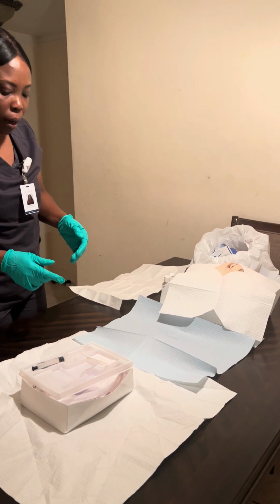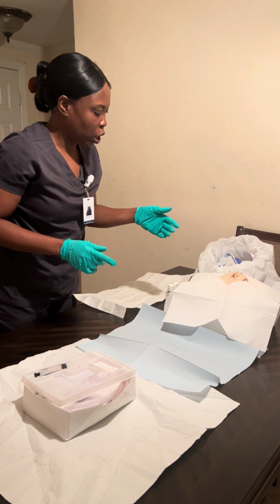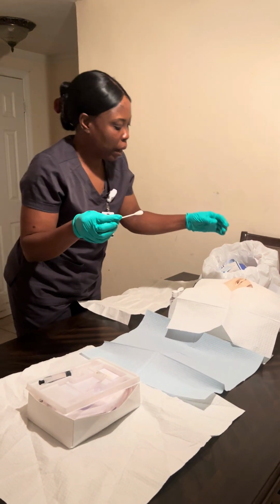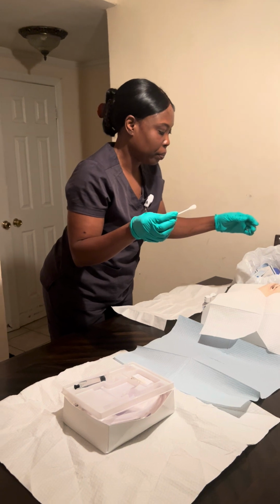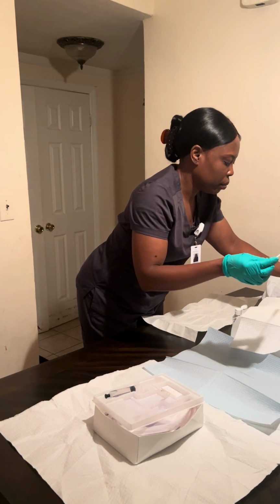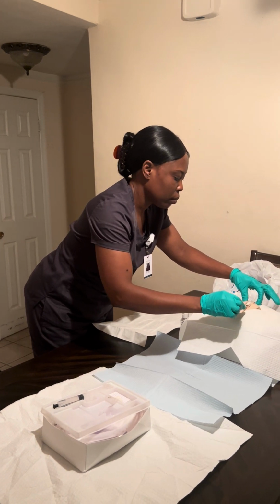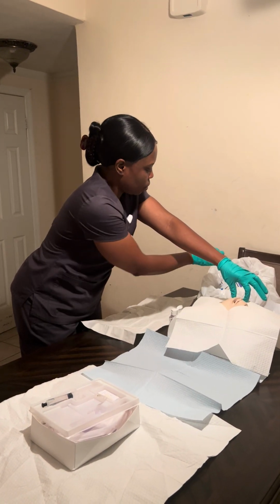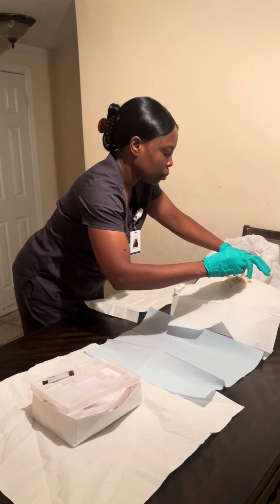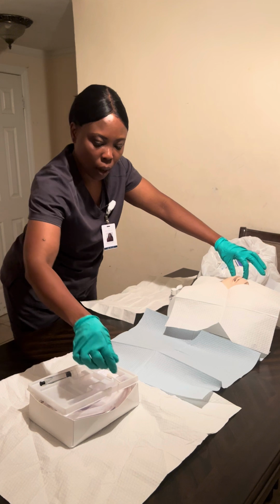Now, Mrs. Smith, I'm gonna clean the area for you. You can feel my hand touching you, okay? I'm gonna clean from the top to the bottom, and then in the middle area, from anterior to posterior. Mrs. Smith, you're gonna feel my hand touching you, okay? I'm gonna clean the other part now. I'm gonna clean the middle part now.